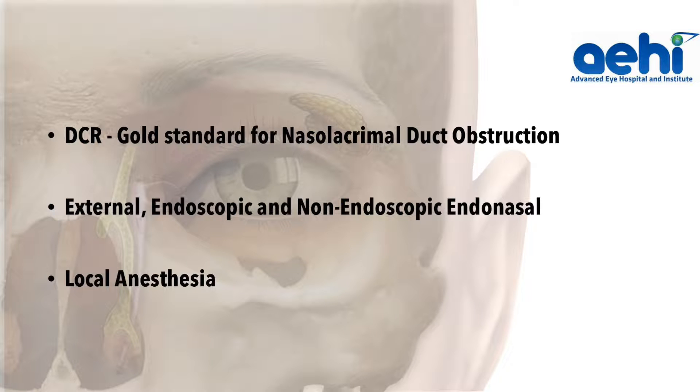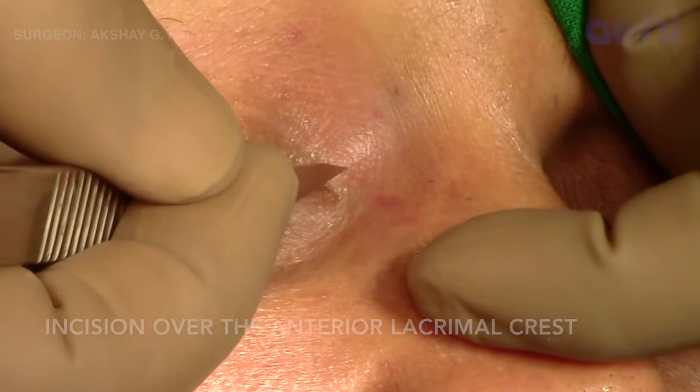A Dacriocystorhinostomy, or DCR surgery, is the gold standard for the treatment of nasolacrimal duct obstruction. In this video, we are demonstrating an external DCR.